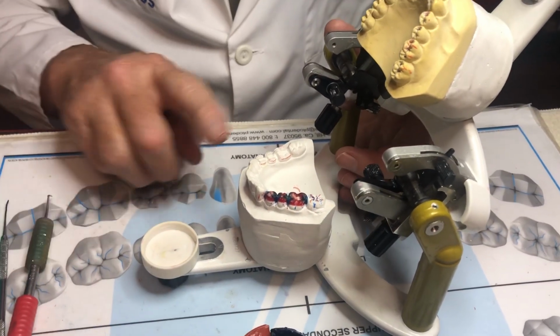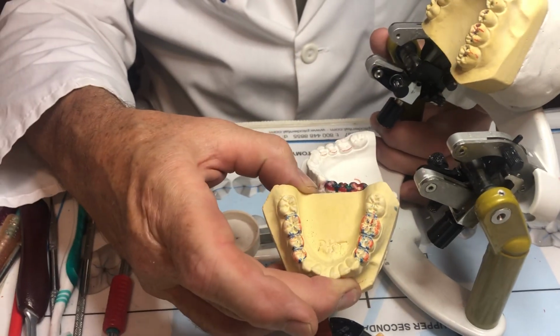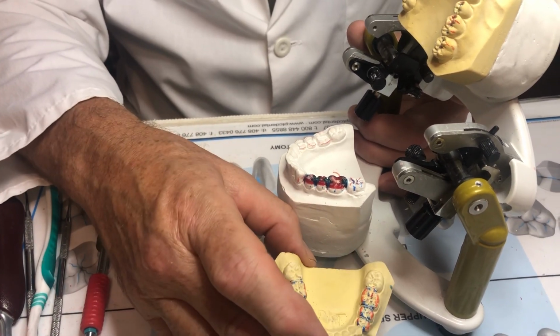So it actually looks simple, it's not, but you'll get the hang of it as you keep working with it. But remember, look at the book first, think of what you're doing, keep this master model in front of you at all times. The book has to be in front of you, because at this point you do not know any of these contacts. You're going to be learning them one at a time.